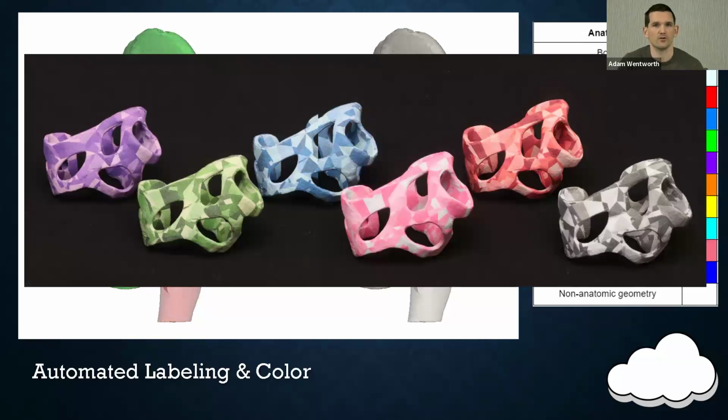It also lends itself to some kind of personalization. Through automation, these demo hand splints get broken up into thousands of surfaces and randomly colored using a color palette that's defined. So, having things for pediatric patients or things where aesthetic may be a larger part of the performance value of that object, enabling customization through that easy scripted thing is a big advantage.